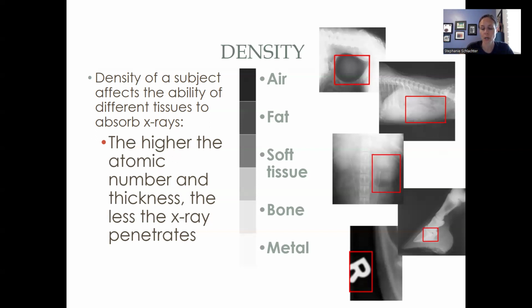So that's our markers. But also if a patient has any orthopedic implants, maybe even a pacemaker and they have metal wires in them, or maybe they got shot or injured or something like that, right? Or they ate something metal that they shouldn't have. Okay, so all those things will show up white then on the x-ray.